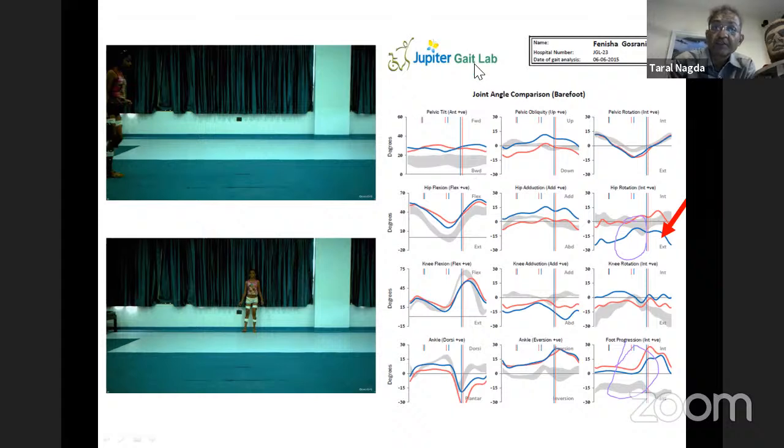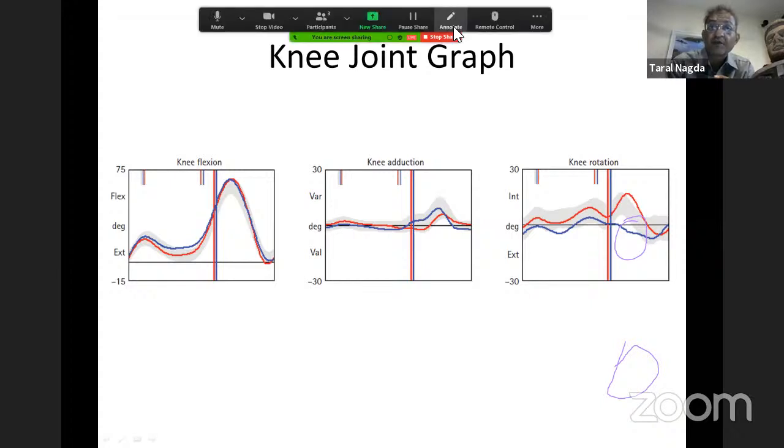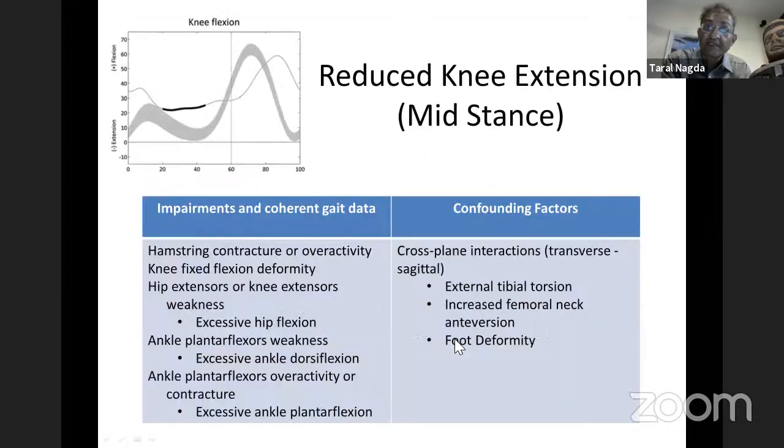So it's very important to see what deformity you see on graphs. Your mind should start working, and you should start seeing where that deformity is coming from. This is the training. Training is required to see across the graphs, up and down and left and right. And the more graphs you see, the more your eyes will get trained.